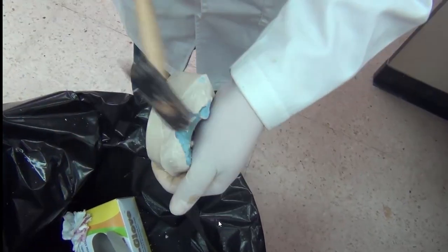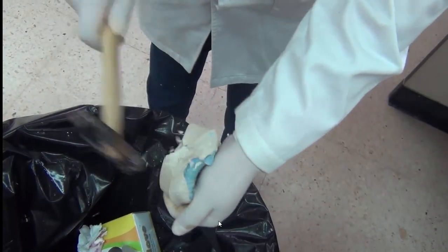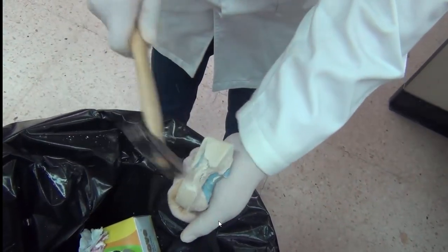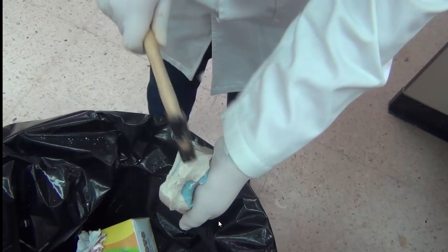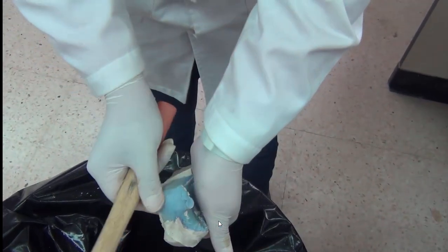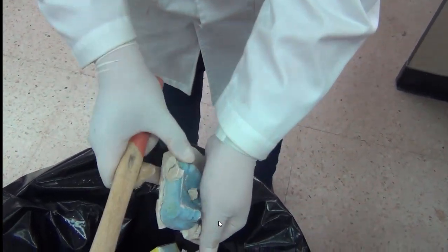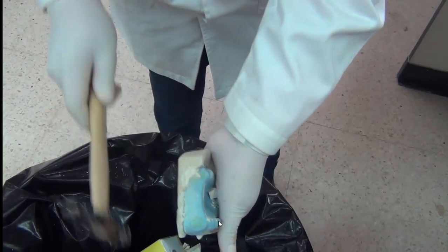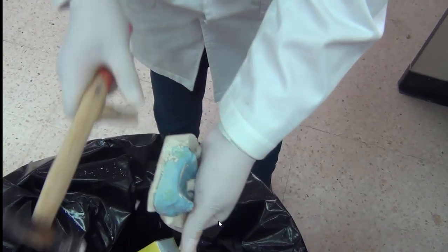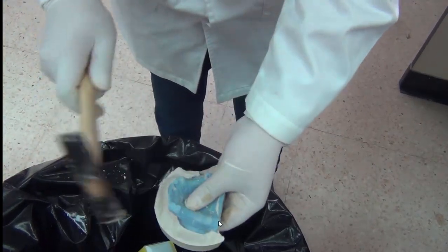This is why we use a plaster around the secondary cast, because it's softer and its impact strength is lower. So when we hammer, the probability that the plaster will break is higher than having the fracture of the cast. So we use the gypsum plaster type around the secondary cast because it has a lower impact strength and it will fracture rather than having the cast fracture.